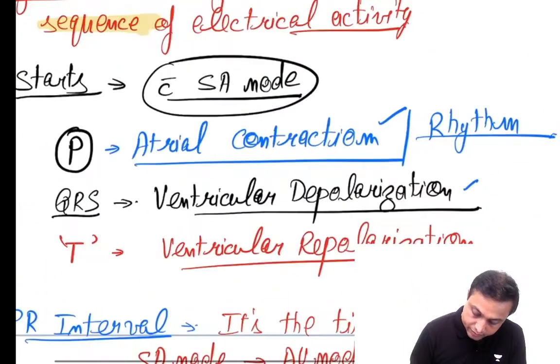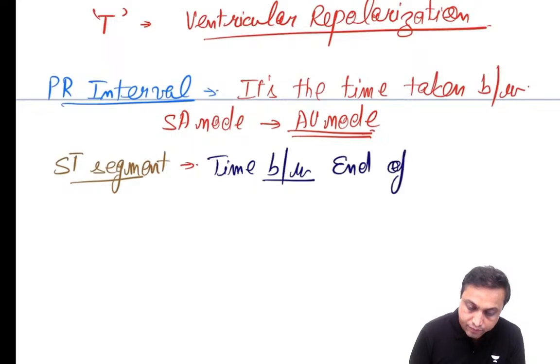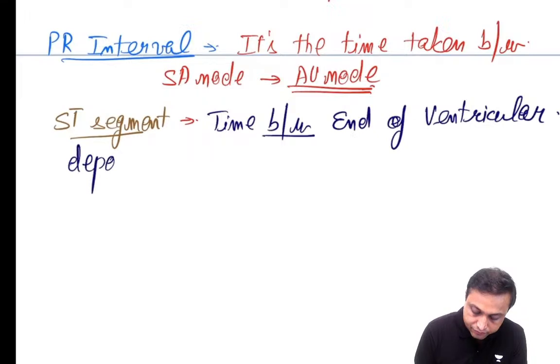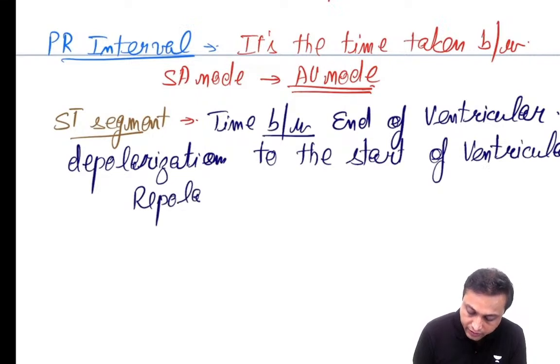So what is this ST segment? Do remember, my dear friend, that this ST segment is the time between the end of ventricular depolarization to the start of ventricular repolarization.